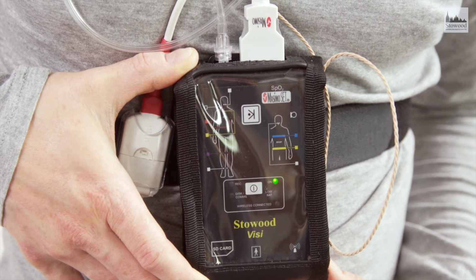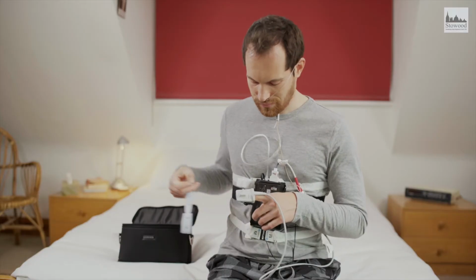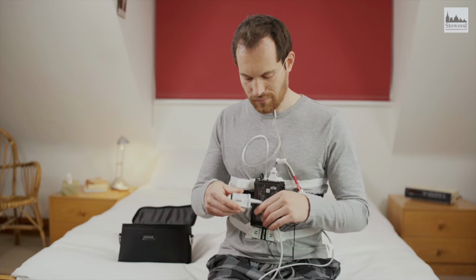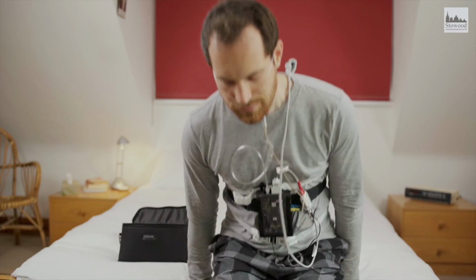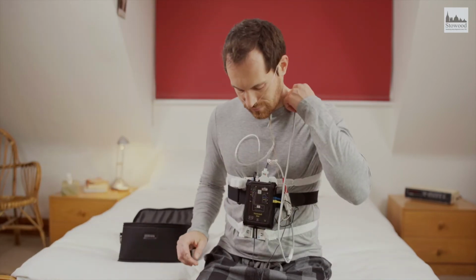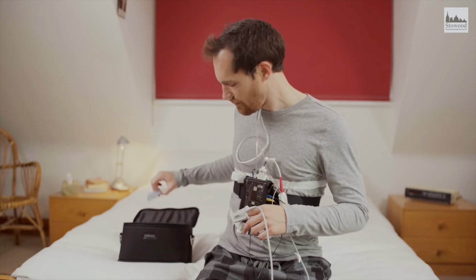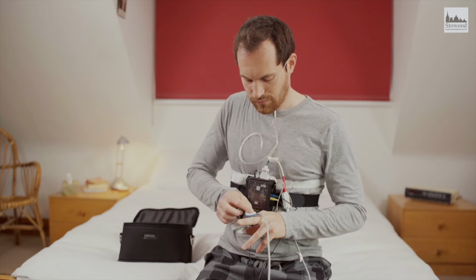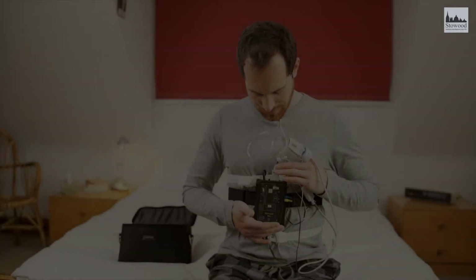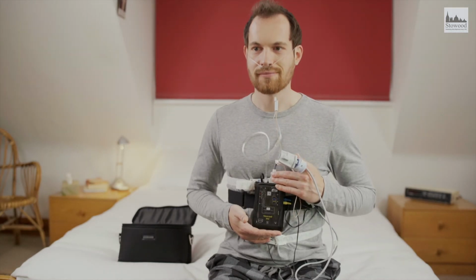The device is programmed to stop recording after a certain number of hours. If you need to go to the toilet in the night, take off the oximeter probe and leave everything else on. When you return, make sure to put the oximeter probe back on. When you wake up, if you didn't sleep as well as you normally do, don't worry. Your device should have captured sufficient information for your clinician to make a diagnosis.